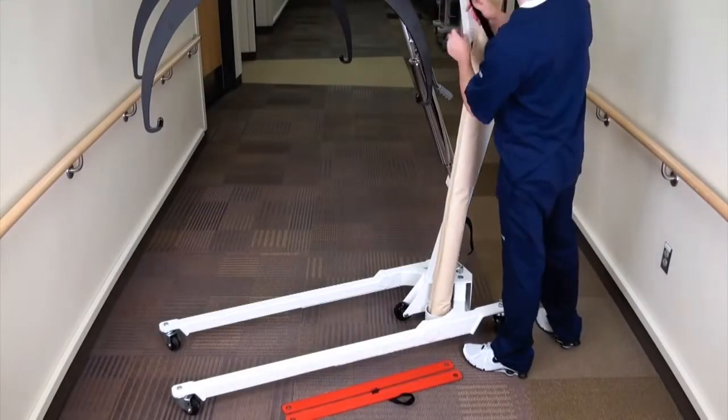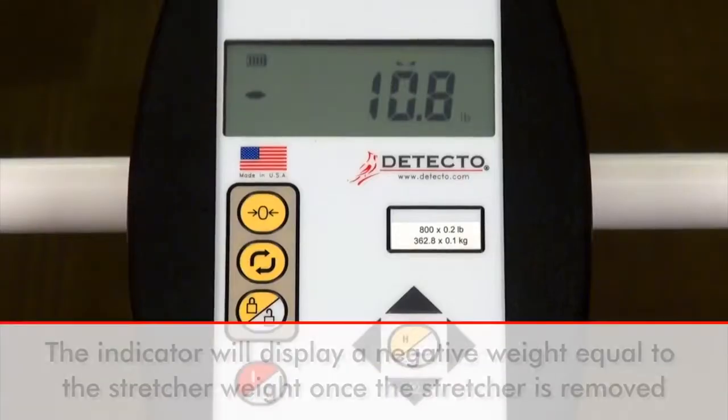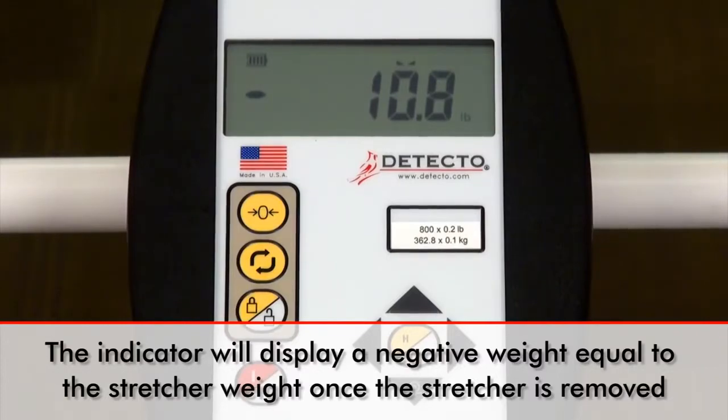Remove the stretcher, roll it up, and secure it to the column once more while replacing the red transport bars. The indicator will now display a negative weight equal to the stretcher's weight.